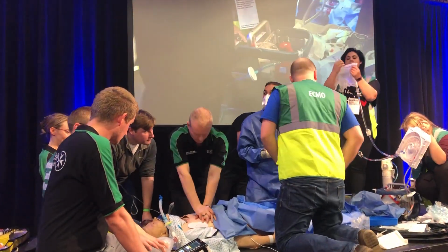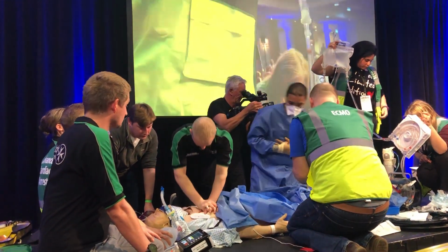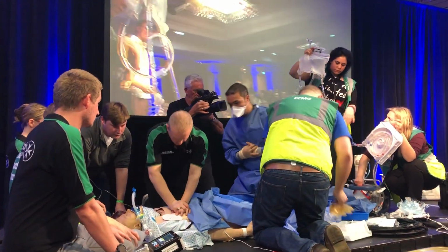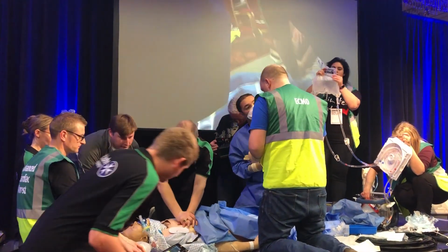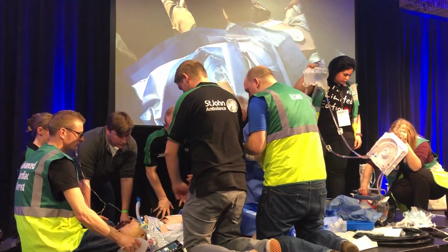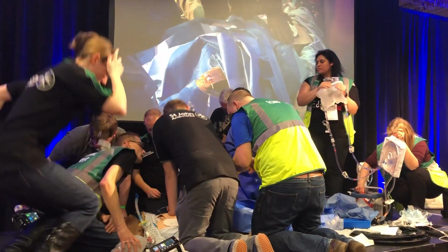Perfect. Check. Okay, so you hit all our criteria, at which point carry on CPR, but we're now fully committed to ECMO. The patient's now going onto ECMO. So effectively, what we're going to do is dilate those wires and put in some big tubes. That's effectively it.